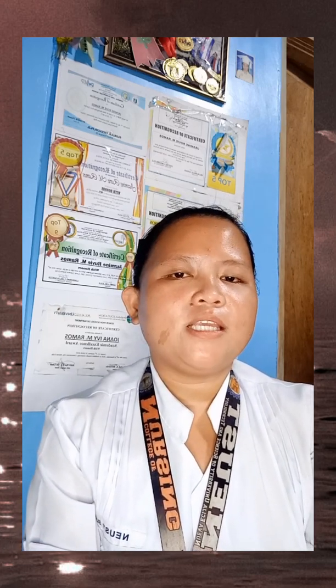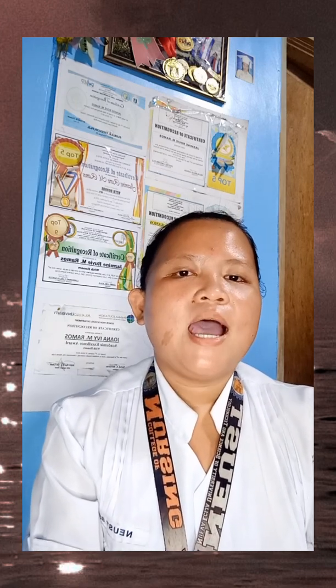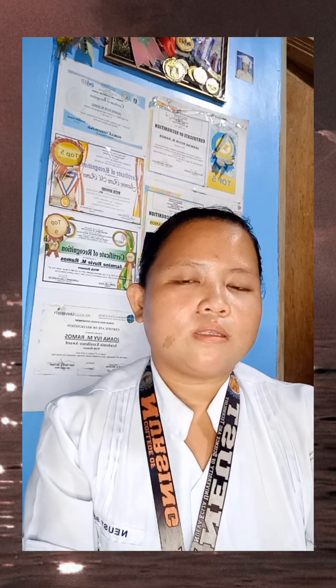Grasp the catheter firmly 5 to 7.5 cm or 2 to 3 inches from the tip. Ask the client to take a slow deep breath and insert the catheter as the client exhales. Slight resistance is expected as the catheter passes through the sphincter. If necessary, twist the catheter or hold the pressure on the catheter until the sphincter relaxes. Next, advance the catheter 5 cm or 2 inches farther after the urine begins to flow through it.